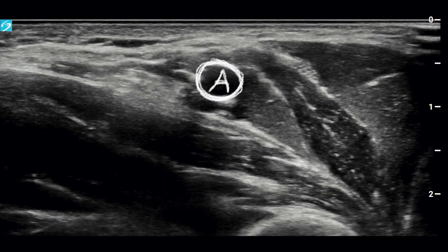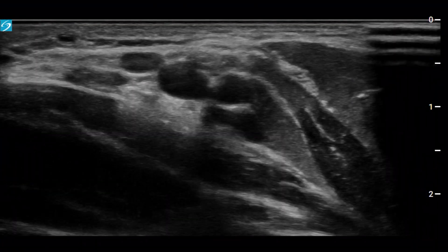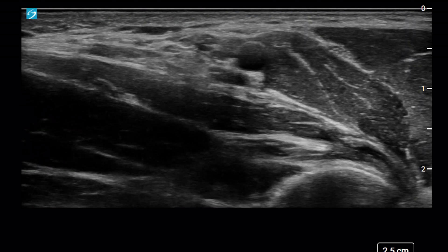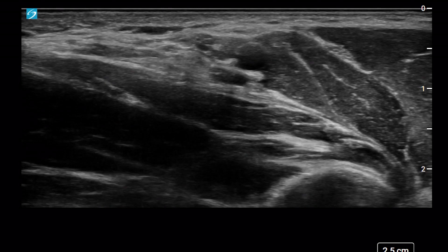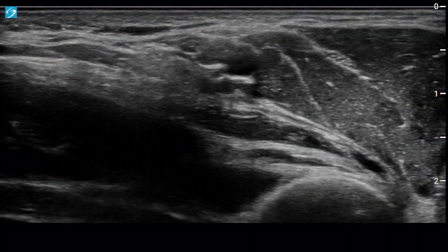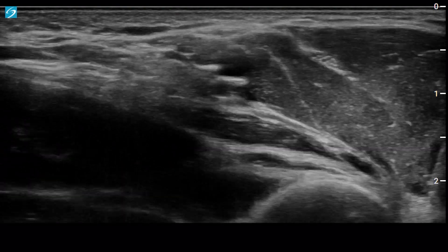In the middle of the screen the large veins are easily compressible. Two of the first cases of local anesthetic systemic toxicity reported with ultrasound were with this block — I think some had the death grip, pressing down hard on the probe, not seeing anything there, and then putting local in. Always start with aspiration negative. If you relax the probe before you start you can see where those veins are — the lightest touch collapses them. The artery is the only one that's not compressible and is pulsatile.